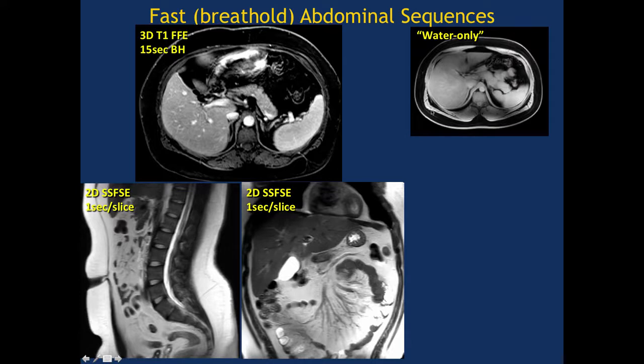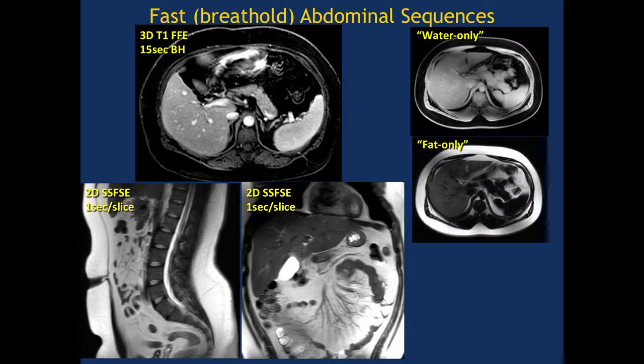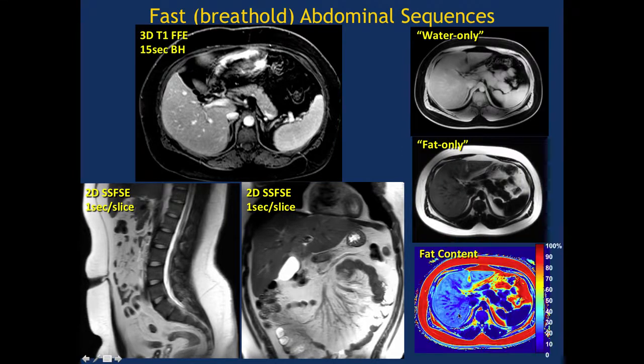As I indicated in part 1 of this podcast series, we can distinguish water from fat, and we can make an image of the water-only component, the fat-only component, and even quantify the level of fat content in the liver, doing a combination of water-only and fat-only and appropriate control of relaxation times and so on to look at different levels of fat contamination or steatosis in the liver and be quite quantitative. This technique is catching on and is very valuable.